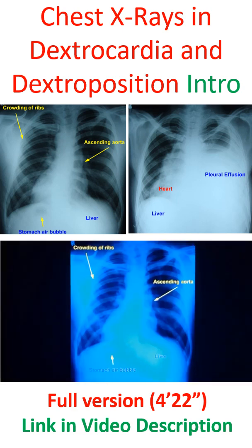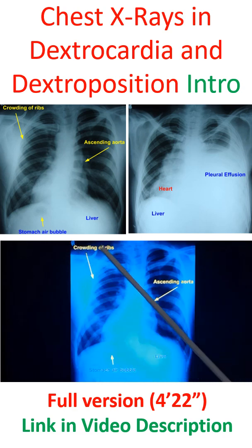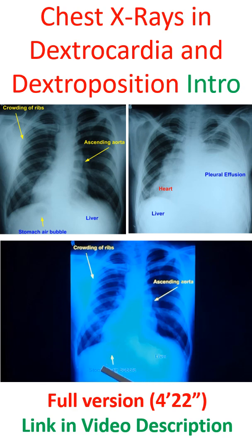This chest X-ray shows dextrocardia. It is because of the possibility of dextrocardia that when you are given a film of chest X-ray, you are supposed to look at the side identification. Sometimes you may be given the film in the reverse direction, so if you don't look at this, you will miss dextrocardia. In this case, this is a mirror image dextrocardia.